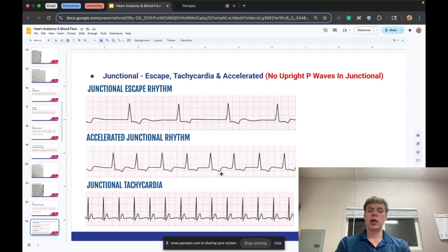That's why it's really important that you look at an EKG and understand how to read your rhythms, so you can understand what's actually going on with your patient as opposed to just looking at the pulse. Because let's say you're in the back of the ambulance and you put a pulse ox on someone and you say, okay, this person has a pulse of 100. That's a normal heartbeat, right? But you could have missed that it was a junctional rhythm, which might be important. You never know.